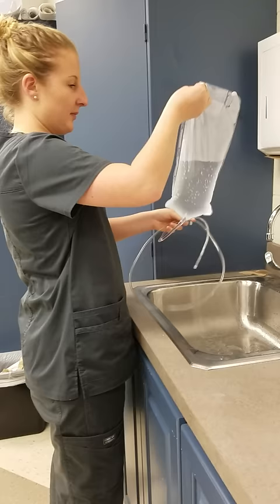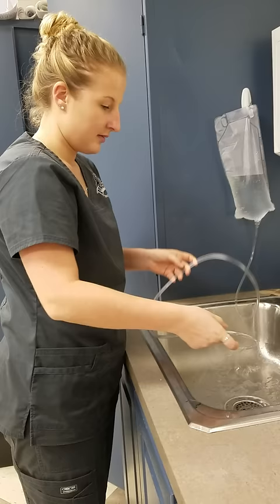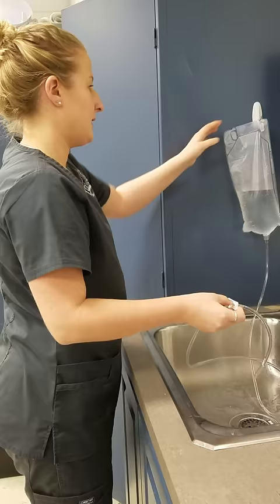After I fill up my bag, I'm going to hang it on a clip and I'm going to unclamp it to prime my tubing to make sure that there's no air in there. I'm going to clamp it back and take it into my room with me.